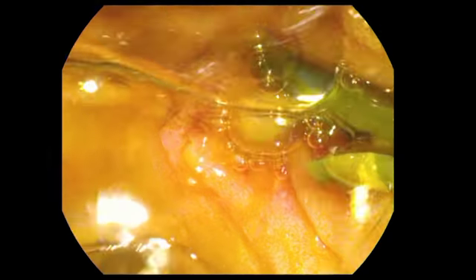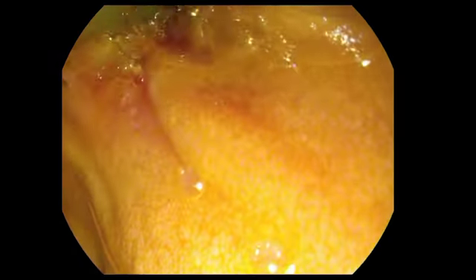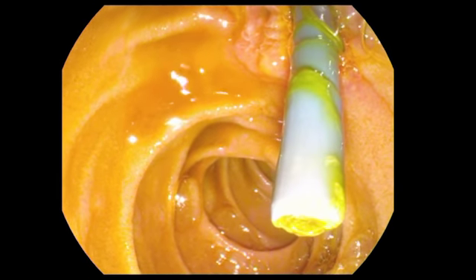It's not a lesion for ampulectomy. And I think the first step is to remove this stent, which is occluded. And you see that the stent is occluded here.